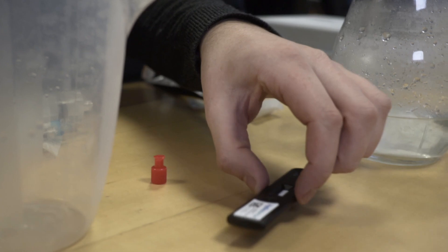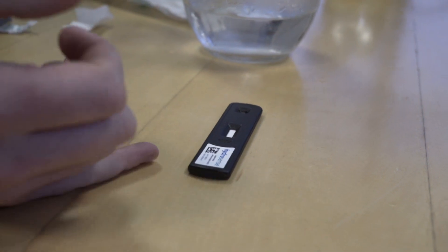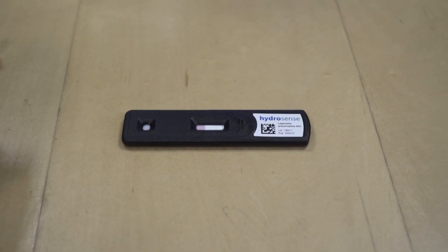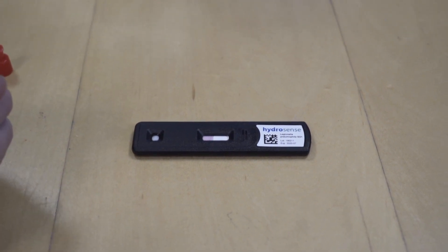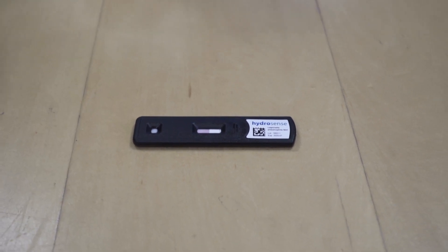And that's it. We're going to leave that for the next 25 minutes and that's going to give us our result — a positive or negative result for Legionella. You'll already see that it's starting to change colour. What you'll get is it'll be a bit like a pregnancy test: one line for negative, two lines and you've got a positive presence of Legionella. So we'll leave that for 25 minutes and in the meantime it's time to go and do the biofilm test.